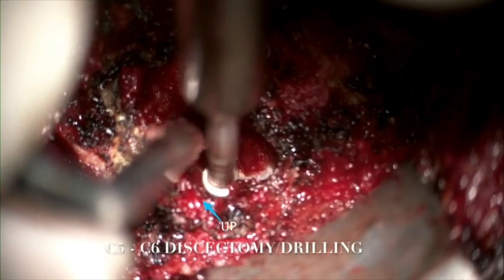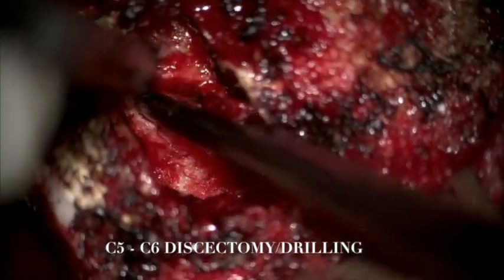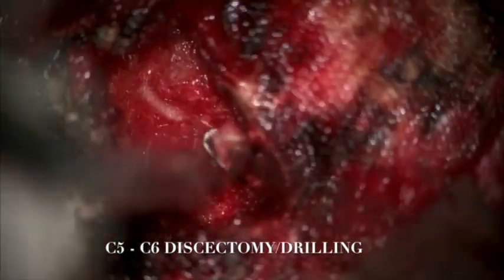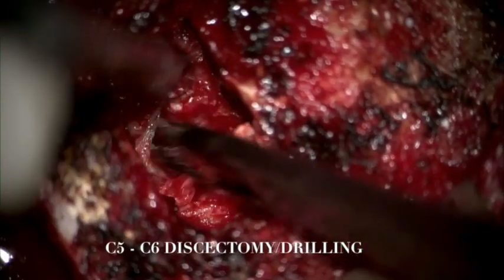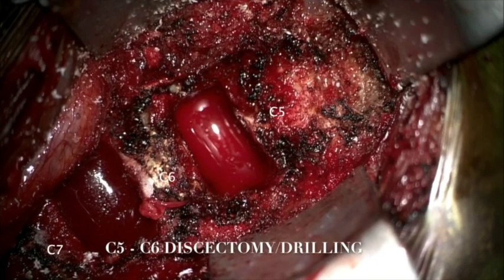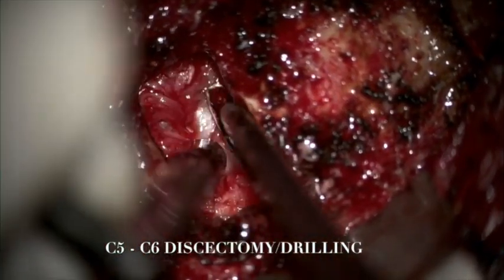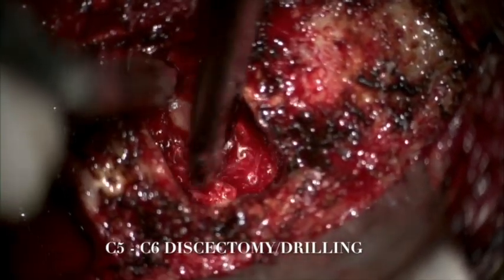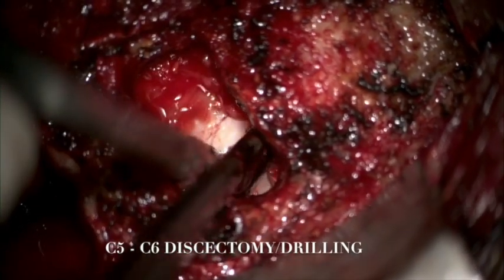We drilled all the way to the medial aspects of both uncinate processes inferiorly. We used 1- and 2-millimeter Kerrison rongeurs to decompress the dura, including bilateral nerve roots at C5 and C6. We confirmed the decompression with blunt micro nerve hooks, making sure to undercut superiorly and inferiorly the intervertebral disc space and osteophytes, providing adequate decompression.